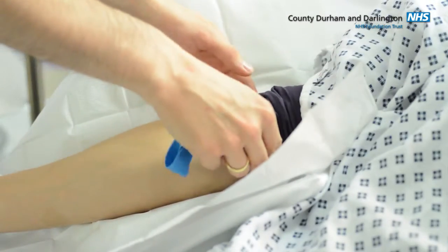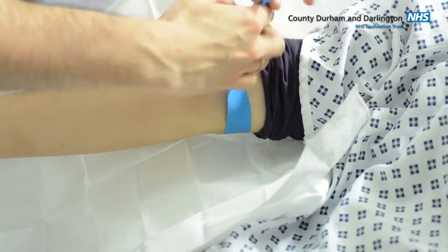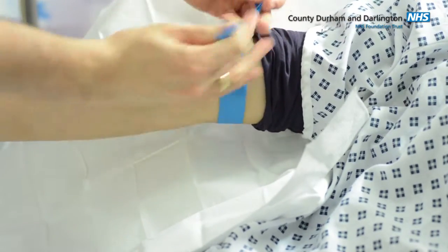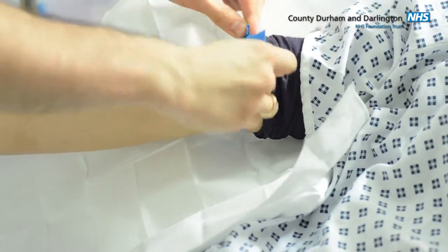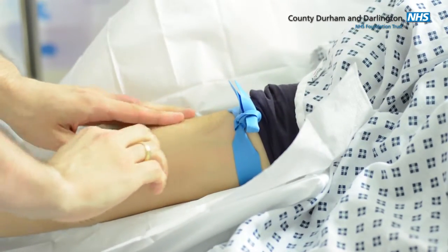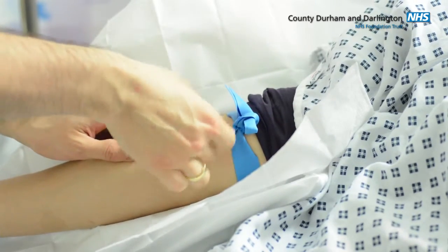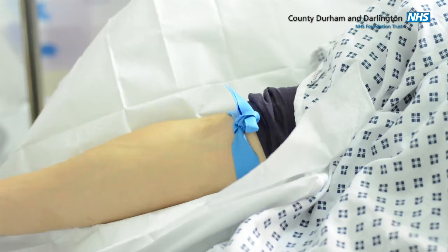Apply the tourniquet. Okay. Can you just lift up your arm? Thank you. Just gonna place this tourniquet around your arm. Might feel a bit tight. Okay, that's fine. And look for a suitable vein. Sorry about this. Just open and close it first for me. Excellent.